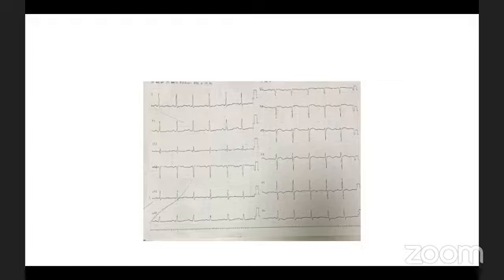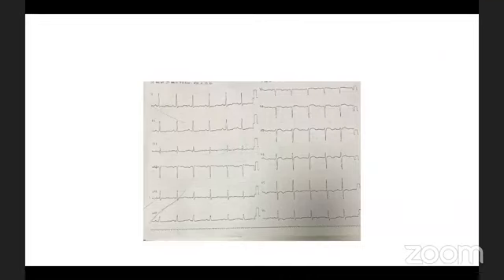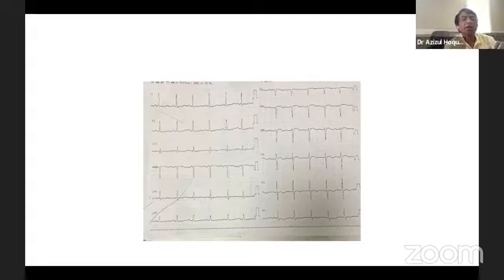Some T wave inversions is basically what we have, and in that case, echo did not help. Does uncontrolled blood pressure, checking pulse and blood pressure unequal on both sides, or back pain, give any clue that may be helpful? But it is my another unfortunate point that it sometimes fools us. My another question is right now, whether he's weak in the arms also or only in the legs.